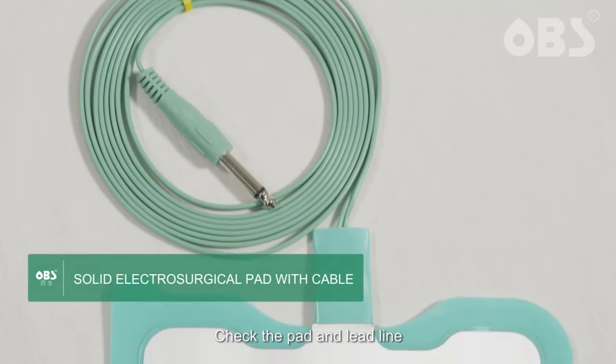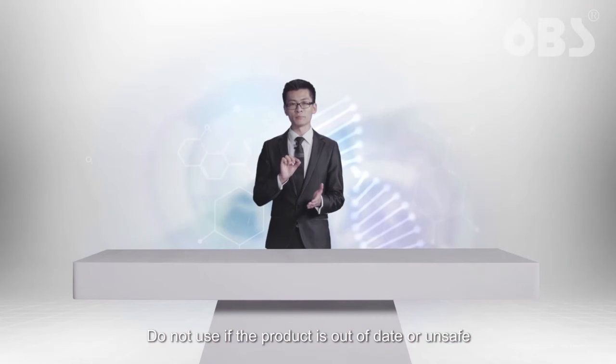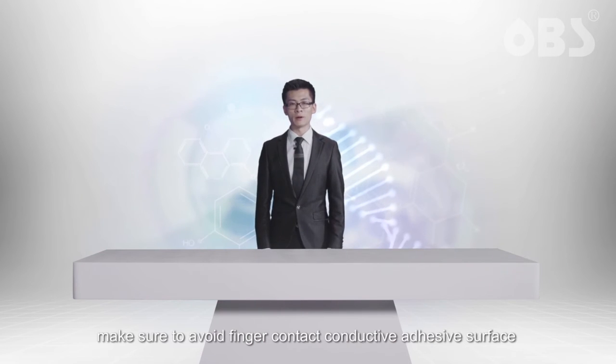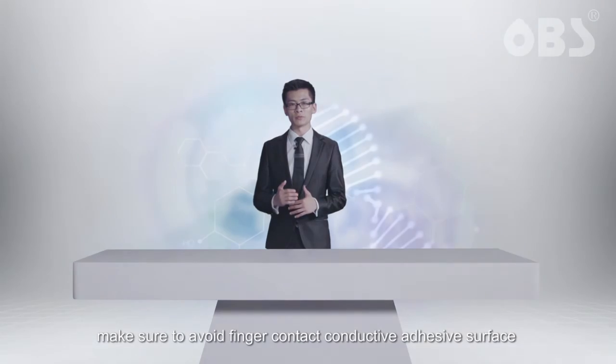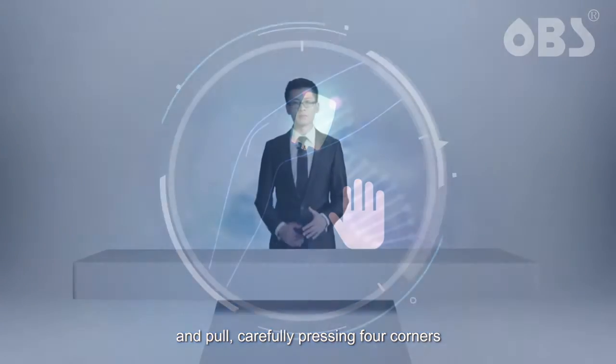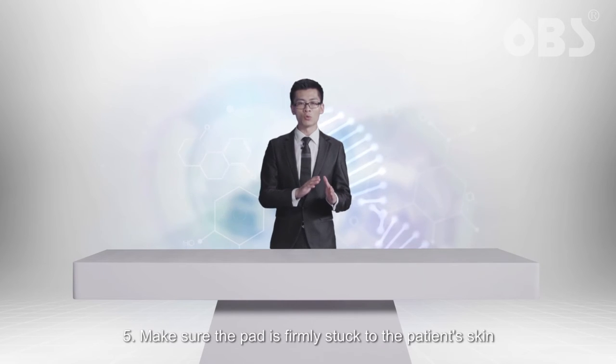Check the pad and lead line. Do not use if the product is out of date or unsafe. 4. After determining the part to stick the pad, make sure to avoid finger contact with the conductive adhesive surface, and pull carefully, pressing the four corners. 5. Make sure the pad is firmly stuck to the patient's skin.